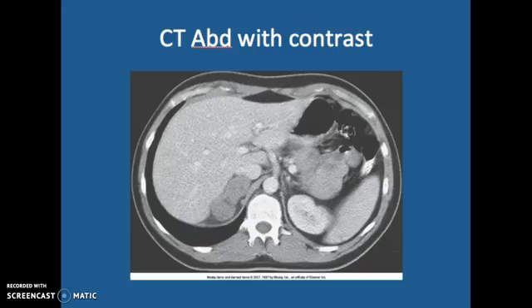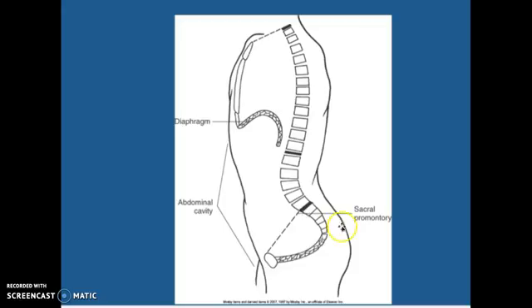This is a CT, an abdomen post-contrast. We have the liver here, here is your spleen, and this is your kidney. When we're looking at a sagittal view of the abdomen, you can see the thoracic cavity here separated by the diaphragm. You have your abdominal cavity here, and from the sacral promontory down to your pubic symphysis, this is your pelvic region.